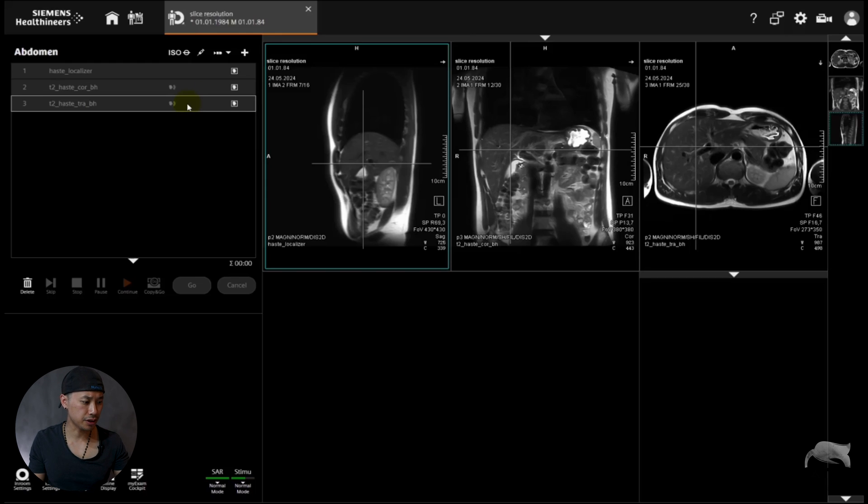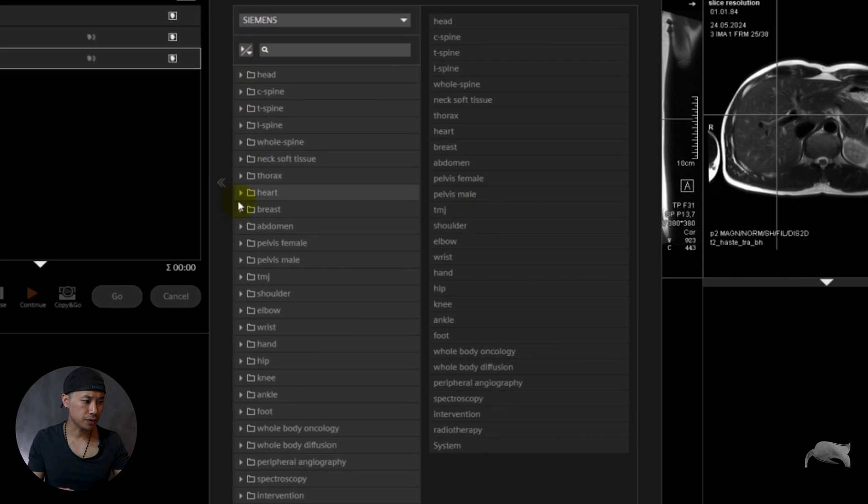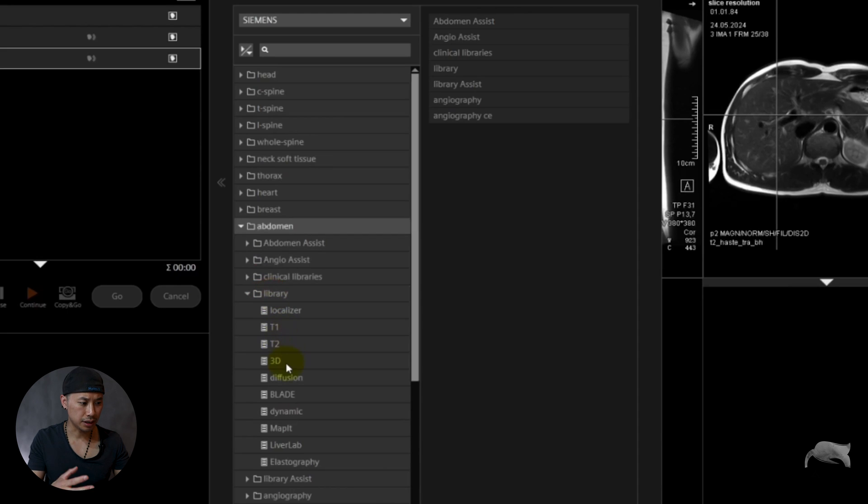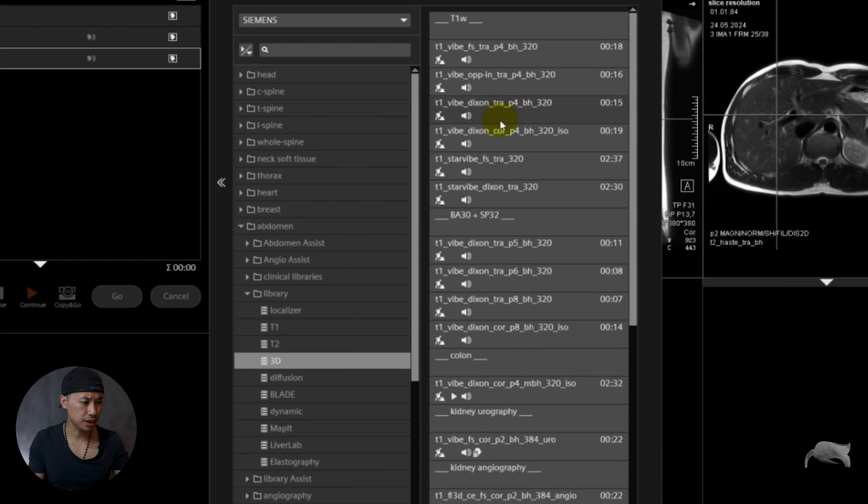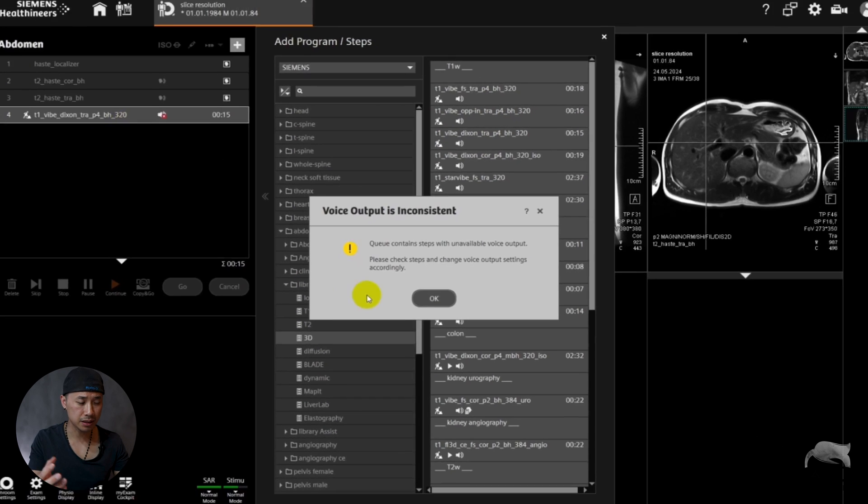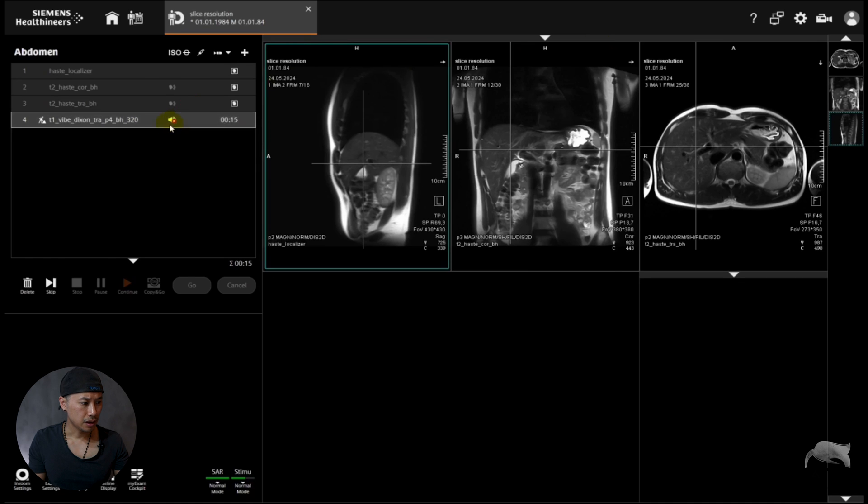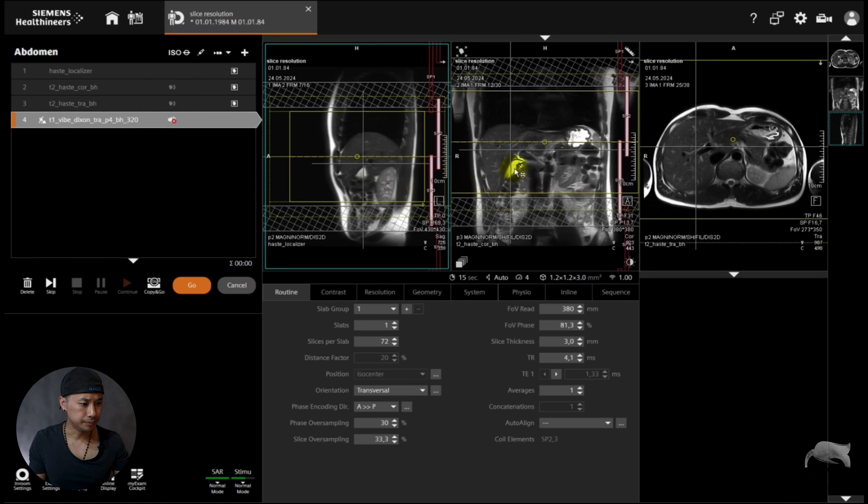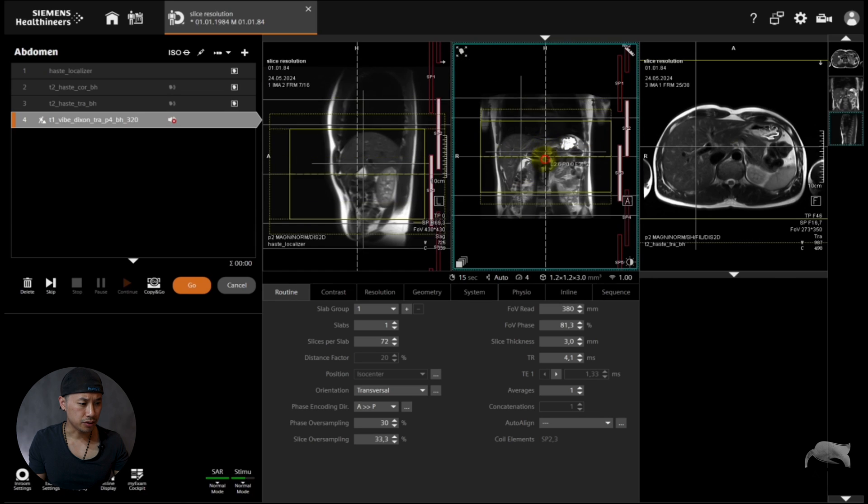We already localized here and I have a coronal HASTE and then the transversal HASTE. Let's find a 3D. We can find it in Siemens 3D right here for the abdomen library. In the 3D we have a lot here, so we just take our transversal VIBE DIXON. So let's open that one.